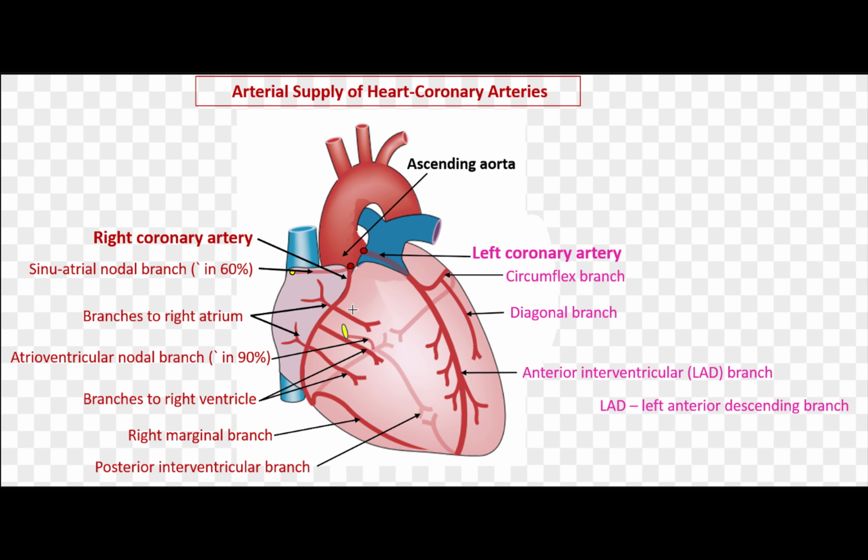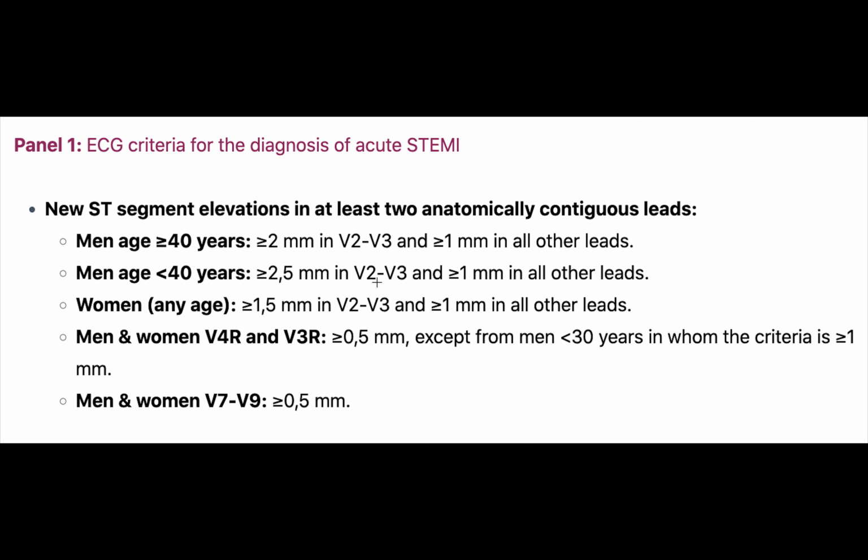We learned about these coronary arteries, what we're looking at, and now we're going to talk about STEMI criteria. And the one who got this question right was actually Joseph Henderson, which makes total sense. He's a paramedic, so he probably knows. He's seen more STEMIs in his life than I have.